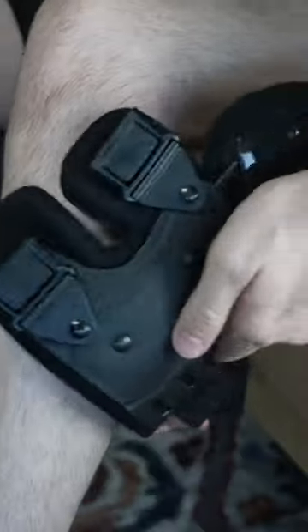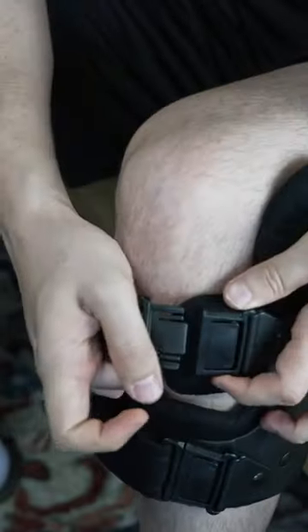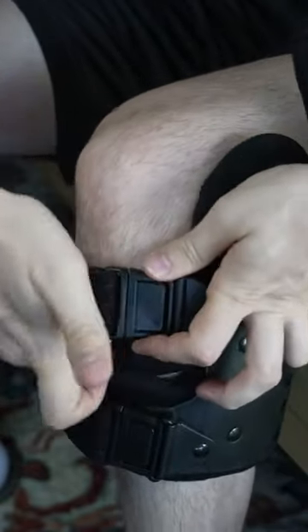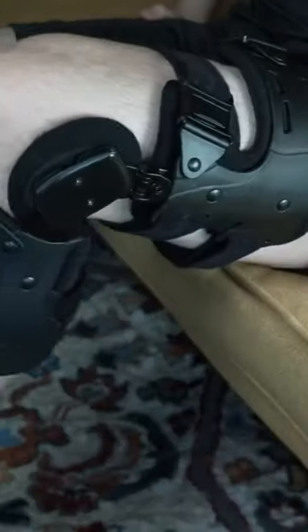First, unbuckle all the straps. Wrap the first strap around your calf for lower leg stability. Wrap the second strap above your calf to prevent sliding. Do the same thing for straps number 3 and 4 for upper leg stability.